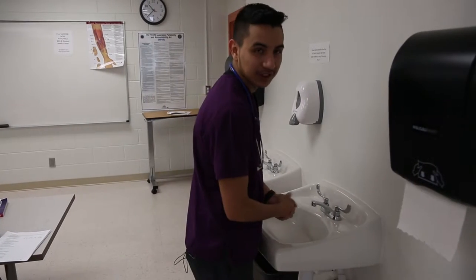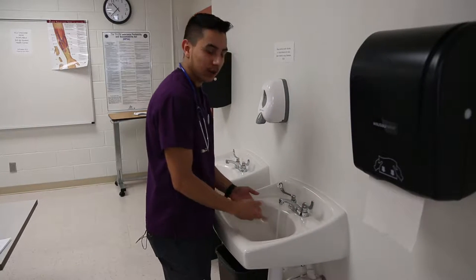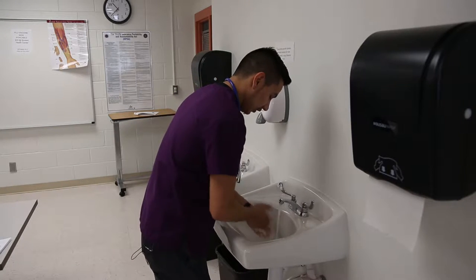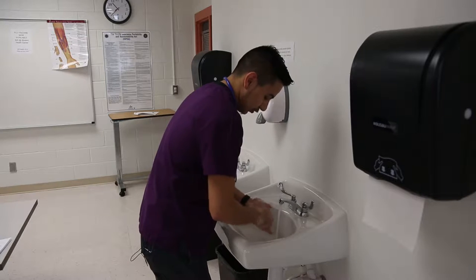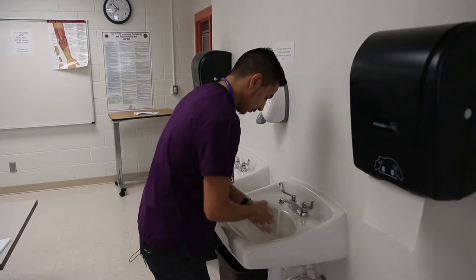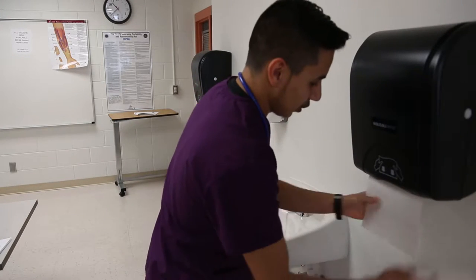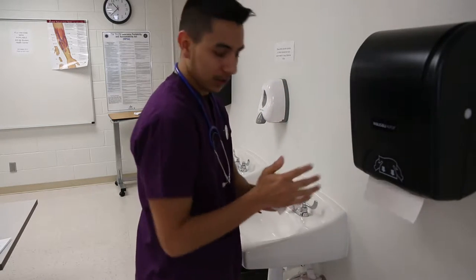Before you begin any procedure, you always want to make sure you wash your hands for 20 seconds with warm water — that way we protect from spreading any kind of germs. Make sure you use soap and wash in between your fingers. Do circles around your palm to get any dust, germs, or anything out of your nails. Make sure you turn off the faucet with a paper towel so you won't get germs on your hands again. And we're all good. Let's go see our patient.